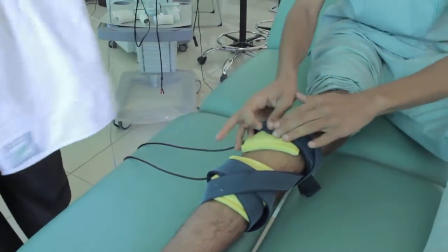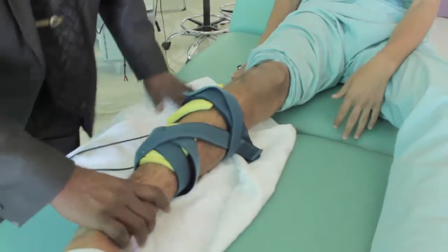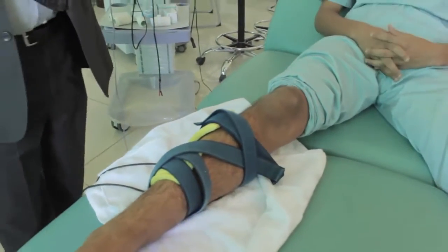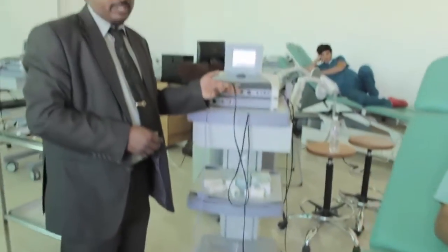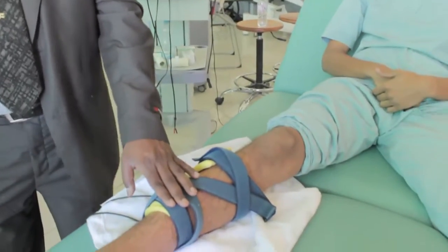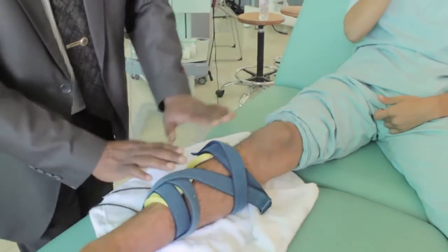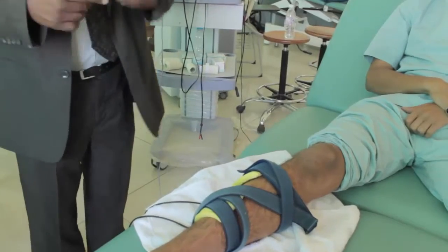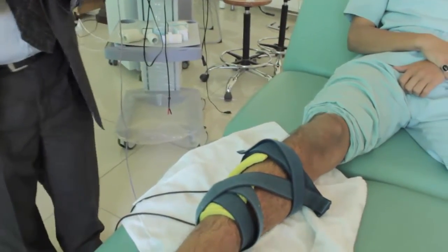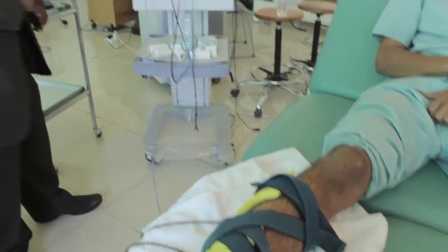Same side, yes. You can stimulate the opposite side also. When you have more electrodes, like this is 2 electrodes. If you have 4 electrodes, you want to stimulate the agonist, that is the dorsiflexor, and the antagonist, that is the plantar flexor. Then you can keep 2 electrodes behind, 2 electrodes here. Okay. Currently we'll start with one group. Then I will tell you the variations. So this is for dorsiflexors.